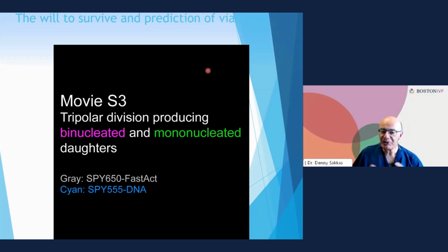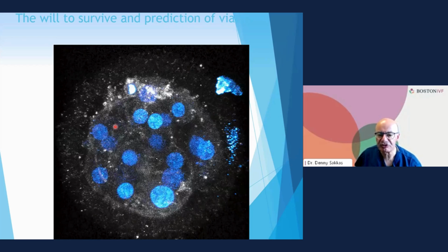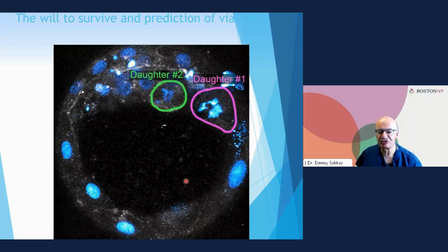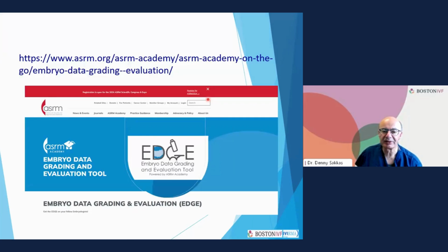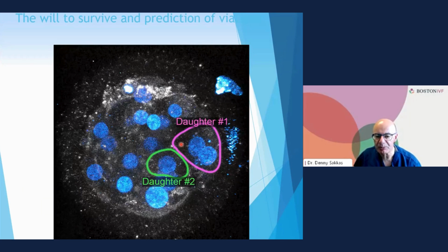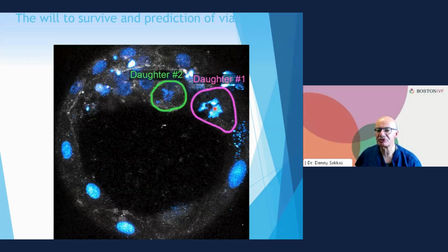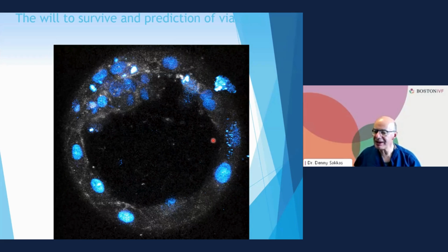The embryo, though, is very tricky, and it does a lot of things that we're not sure about, and there are ways it corrects itself. So this is some work we've been doing in the lab where we can actually live image embryos. These are discarded embryos that are donated for research, and these we can look at. And if you look at this blastocyst, you can see some cells here actually correcting themselves. So some of these were aneuploid. You can see this is the blastocyst. This is the cavity. These are all trophectoderm cells. And you can see, if I go back a second, this is a cell undergoing mitosis. This is the daughter cells. You can see some of them actually correcting aneuploidy and going back to 2 or 3 cells and cleaving 3 times. So the embryo is also pretty smart at correcting itself, it appears, and has some tricks in its bag to make it more normal, if you want.